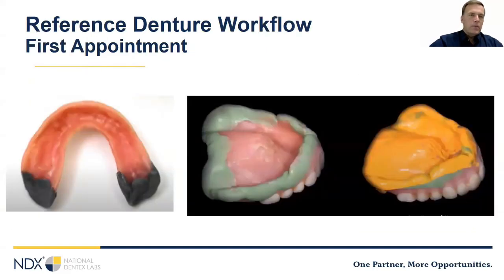Next, and this is probably the most popular, is the reference denture workflow. 80 to 90% of your patients are going to have a denture. Some of them you're going to have to lean on pretty hard to get them to bring the denture. But what you can tell them is, I don't need to make the new denture anything like your existing denture, but I need something to capture your mouth that will save us both time so that you can get your denture more quickly. So if you bring your denture to your next appointment, we'll be able to use that as a way of taking an accurate registration of your mouth.